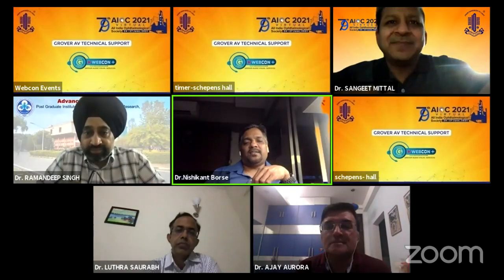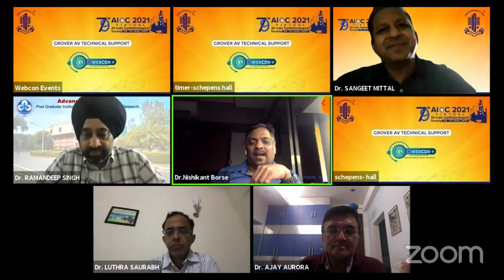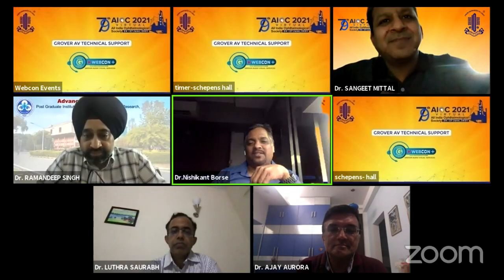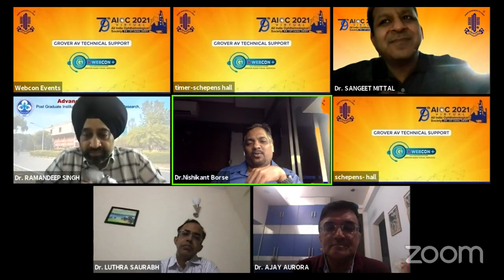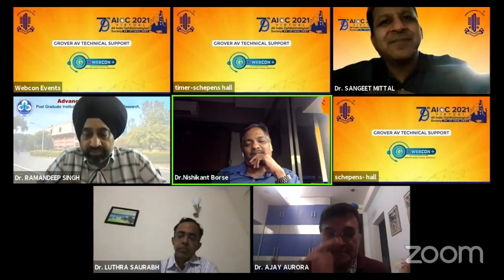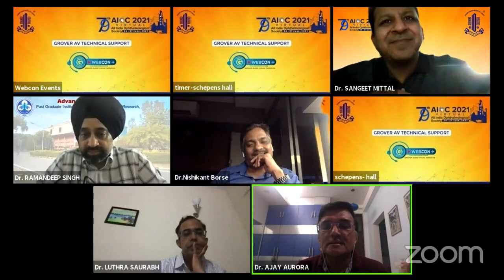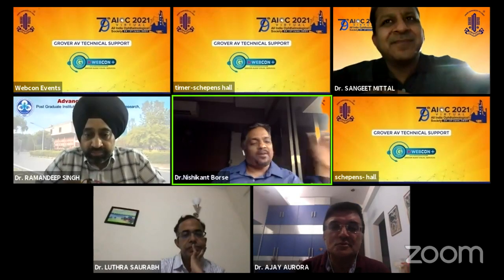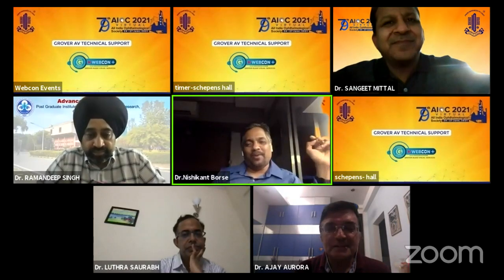So Ajay, what Sangeet does is he cuts the 1 cc syringe and the plunger into half, and then he cuts a bit of the tip of the 10 cc syringe and puts this contraption into the 10 cc syringe with the drug loaded, and then he puts it into the silicone oil injector for injecting. He's developed it. Yeah, I've seen his video, very simple. Ours is also something similar, simple, though something else. But yes, I'll share it with you. Yeah, good. We hope to see it soon, Ajay. You can send one to me to evaluate if you want to.